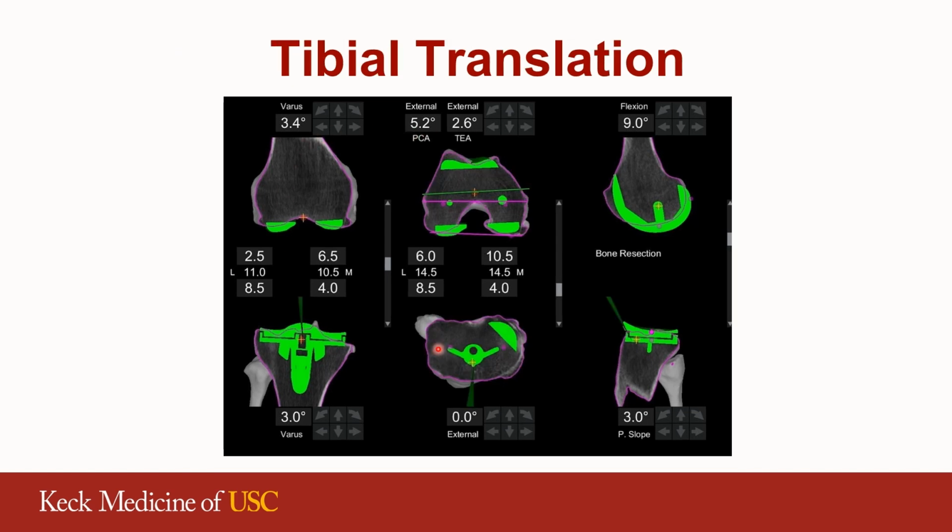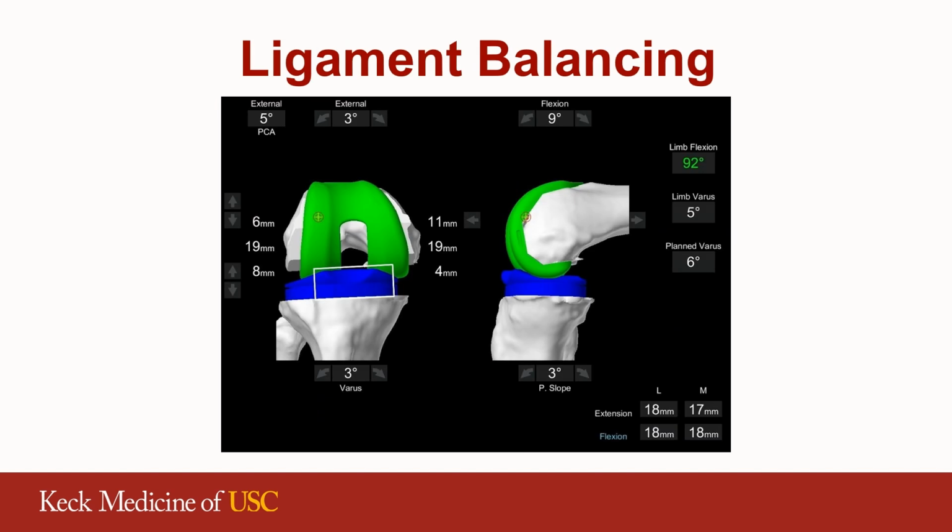Once we've made these adjustments, we'll then take our probe and make landmarks on the actual anatomy so that we can transfer this representation onto the patient's bone. We'll take a look at the center point as well as the 0 degree reference mark for the tibia. Now that we've confirmed the positioning of our components with 15 different checks, we'll then make our cuts and then place the trials. We'll then put laminar spreaders in place and make sure that we have restored symmetric gaps.